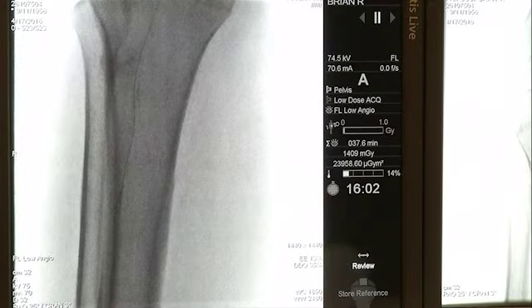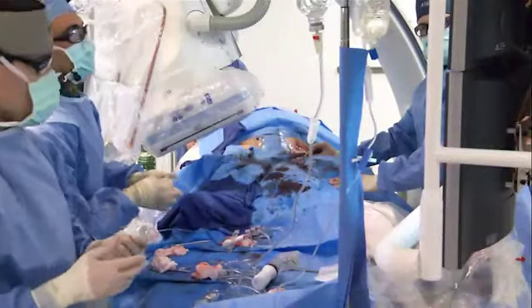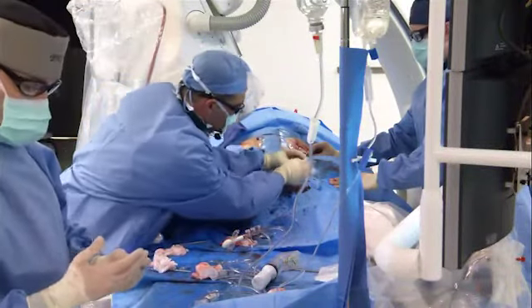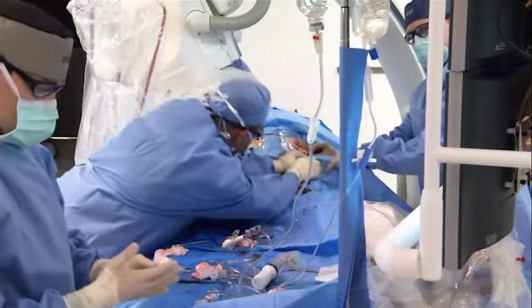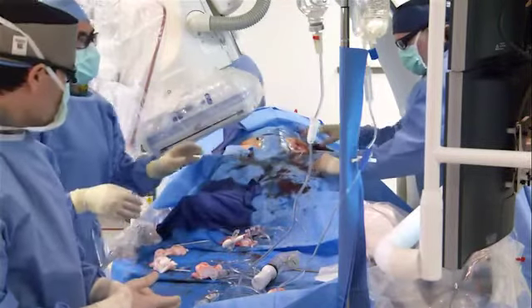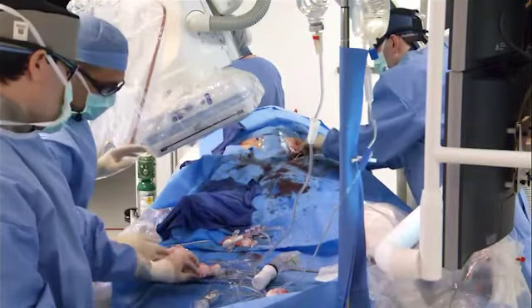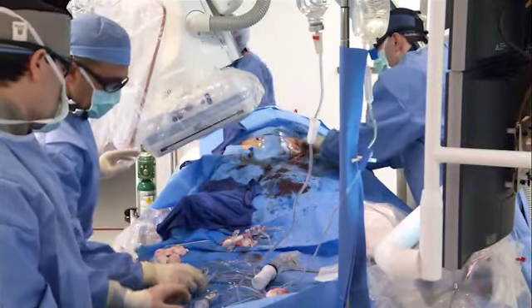Would there be another option to treat this terribly calcified long lesion, like atherectomy? Maybe another option would be an alternative like atherectomy, or is it too long and too calcified? Yeah, I think you can use atherectomy. The only one I would use, honestly, in this situation would be the laser, but it's so calcified. I don't think laser is going to do well. It may. I don't know. I'd be interested as to what other people think.